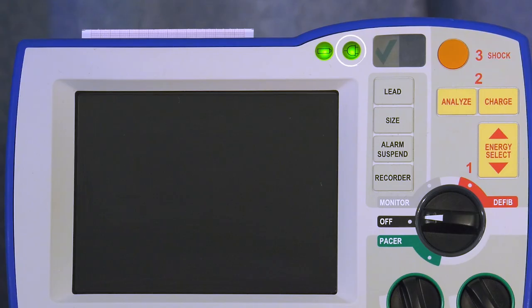The green AC power LED indicates when the R Series is plugged in. The battery charge indicator uses color to indicate battery status. Steady yellow indicates the battery is charging. Steady green indicates the battery is charged. Alternating yellow and green indicates no battery is installed or there is a battery charging fault. Batteries are automatically charged whenever the defibrillator is plugged in.